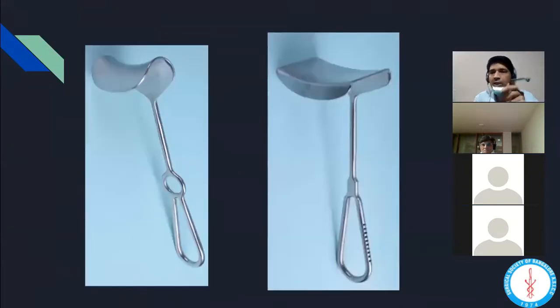So how do you differentiate the two? Both of them have concavity on the top, but when you look from the side, a Doyne's retractor has a curve, a Morris retractor is straight. The other way of looking at it is to lift the instrument like this, make this a circle, it looks like a small letter D, it's a Doyne's retractor.